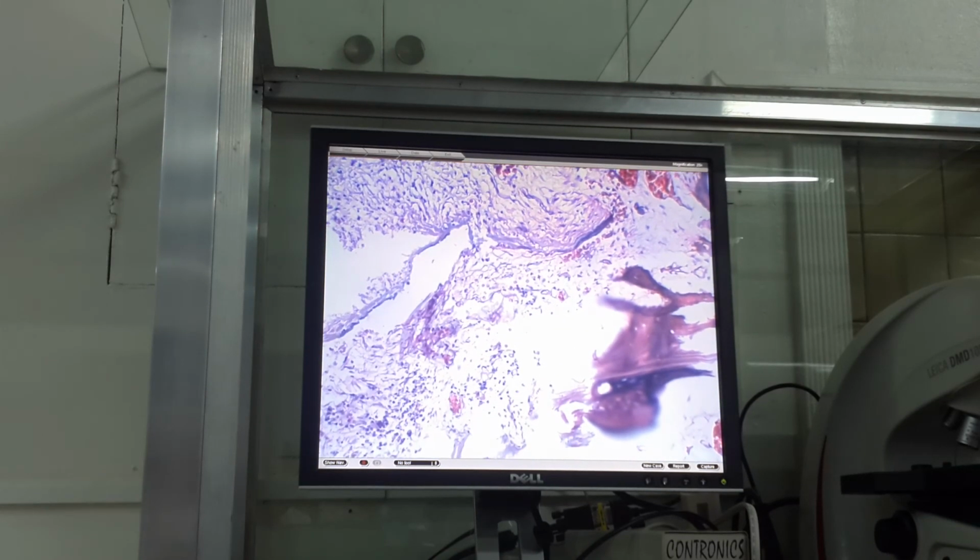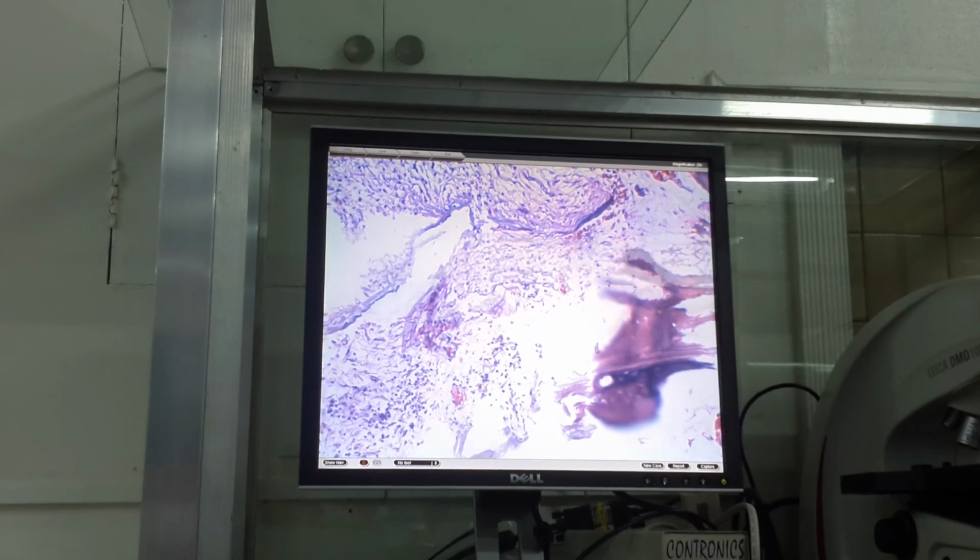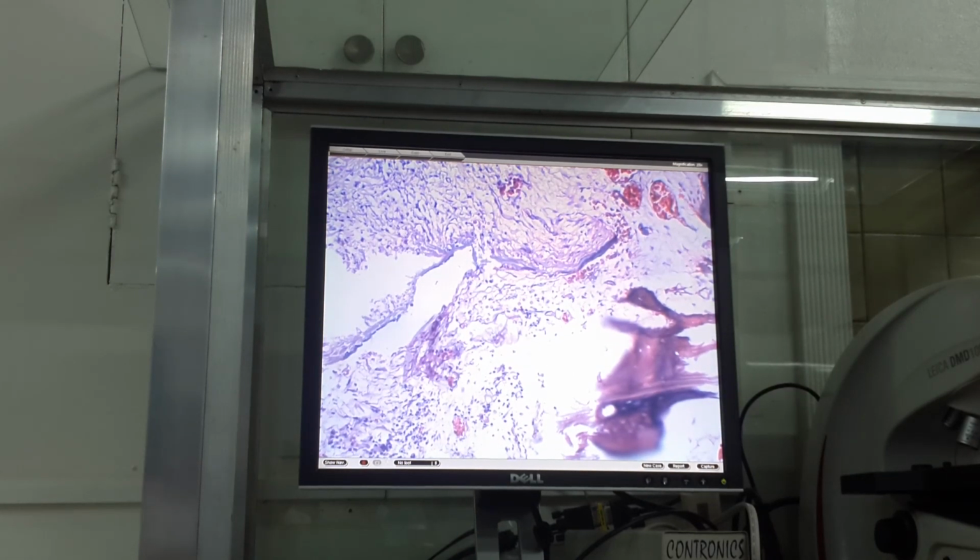O, tago mo ng konti dyan. So this is the bony fragment. You will be able to recognize it, correct? You have lots of tuldoks over here. Blue tuldoks. Those are inflammatory cells. Tama? So those are lymphocytic infiltrates. You still see the lymphocytic infiltrates here and the bony element here. These are small blood vessels. These are fibroblasts putting on some collagen fibers in the area.